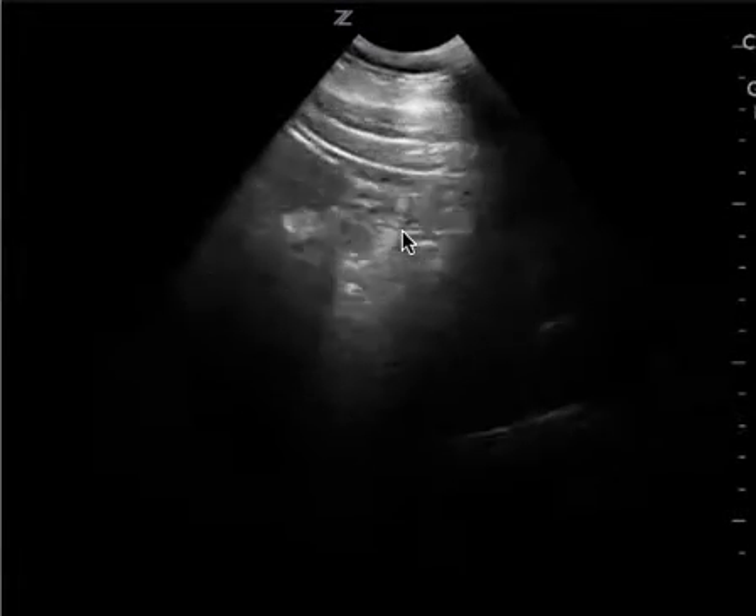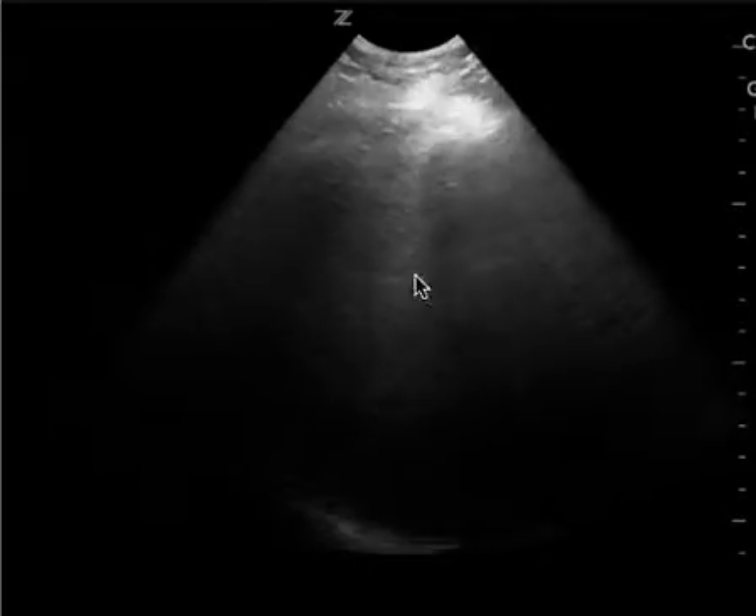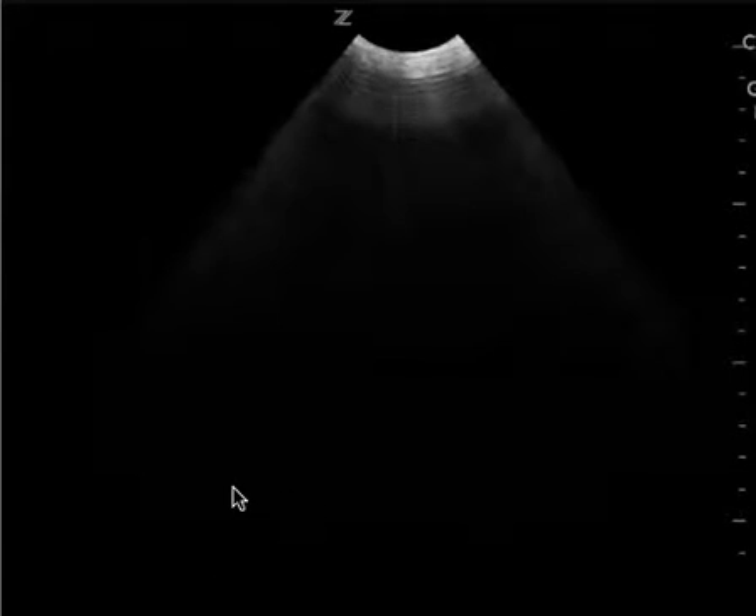All I see here is this one area which is not sufficient. You have this view here which I think is an attempt to try to get the diaphragm, which you see very briefly right there, but again you don't see the diaphragm, you don't see the spine, so the right upper quadrant is technically limited.